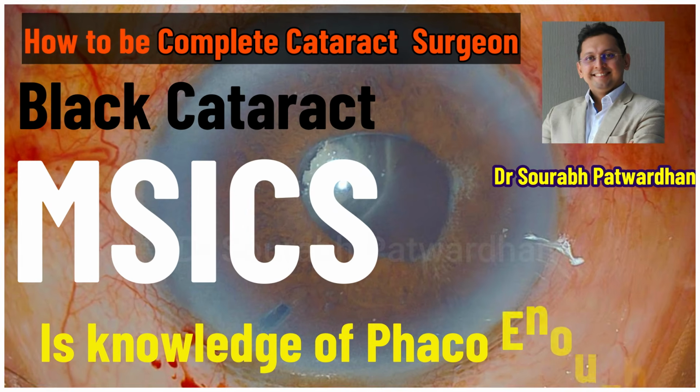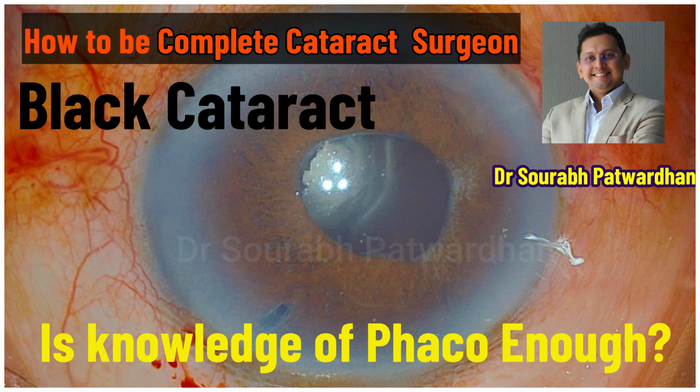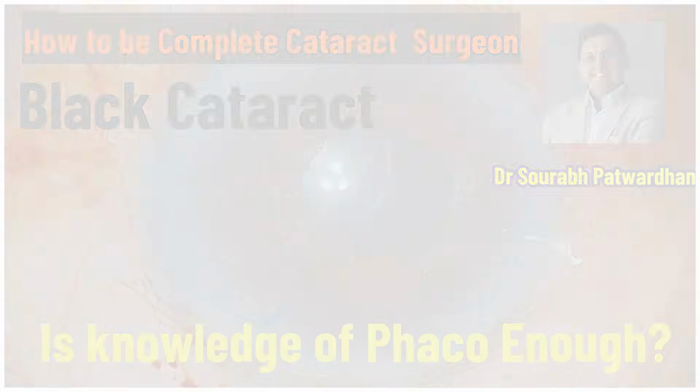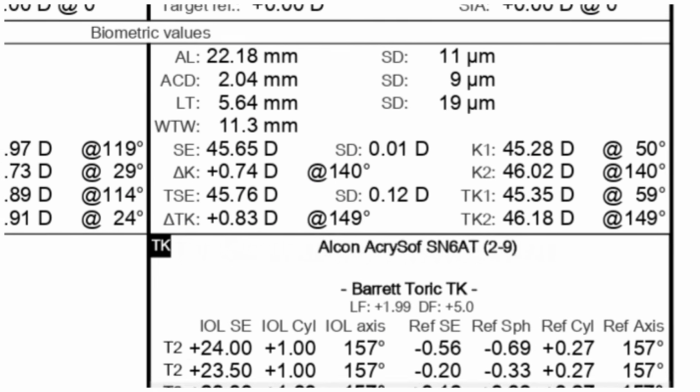In this video, I am going to speak about how to be a complete cataract surgeon. So, is the knowledge of Phaco enough to deal with all cases of cataract? Just watch this particular cataract, very shallow anterior chamber.